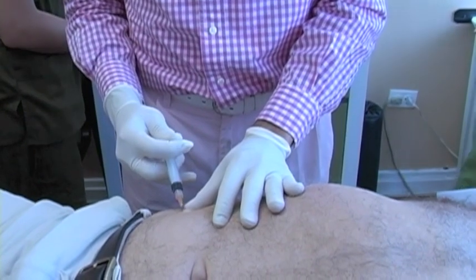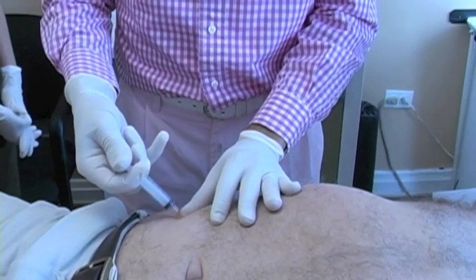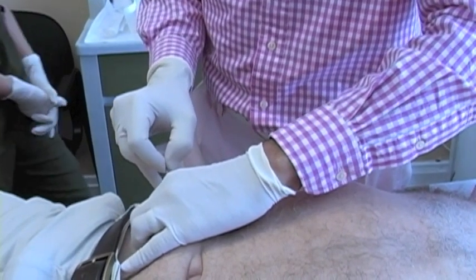Here I'm actually numbing up the skin. One of the innovative type treatments that we do here at Caring Medical is called stem cell prolotherapy.